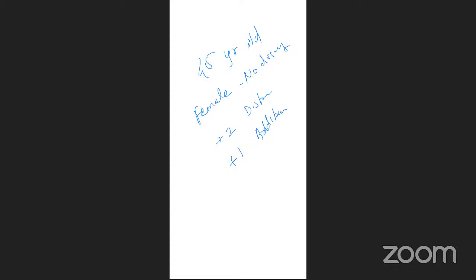Sir, since the refractive error is small, I would like to go for a cornea-based procedure. But I have to rule out whether there is any early cataract or not. If the lens is clear, then I would like to go for refractive-based procedures. You mean corneal procedures? Yes, sir, cornea.